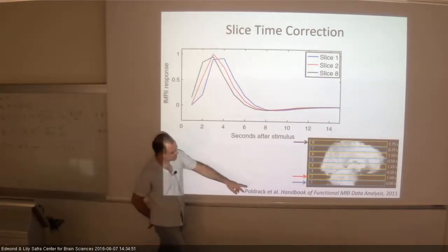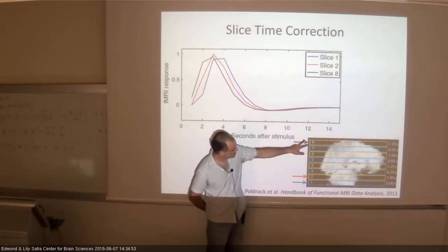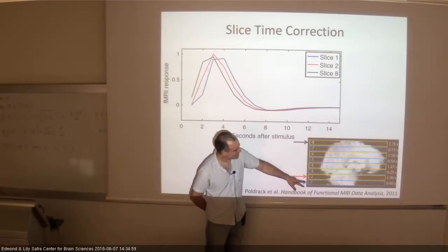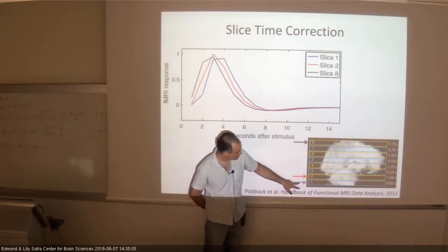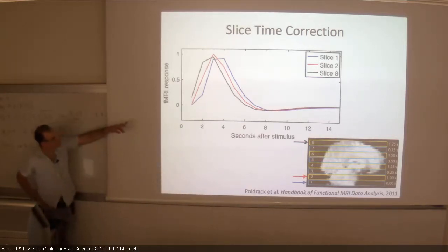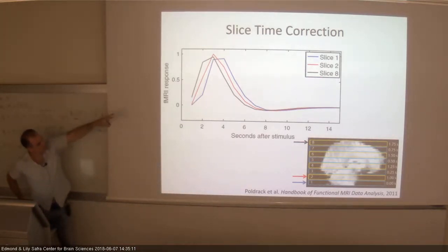In temporal time, and not the ordinal number, we have these slices come first, and then number 3, and so on. You can see that from the graphs. Can you see the different onset, the different dynamics of the 3 slices?